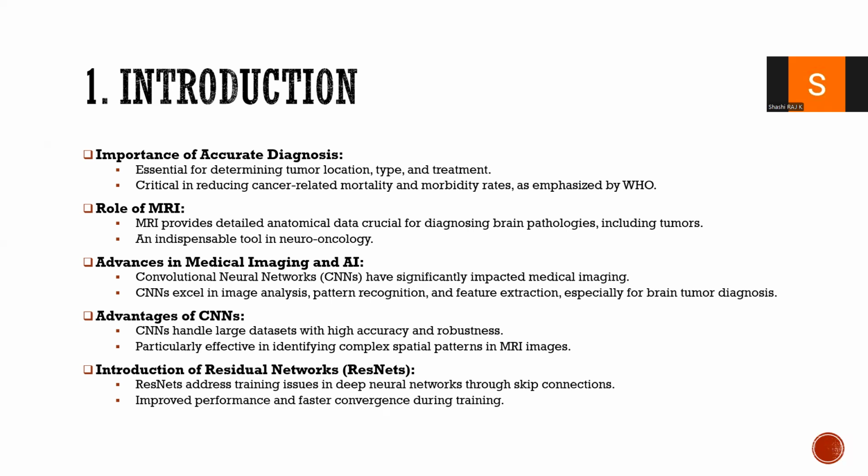Advances in medical imaging and AI. Convolutional neural networks have significantly impacted medical imaging. CNNs excel in image analysis, pattern recognition, and feature extraction, especially for brain tumor diagnosis. Advantages of convolutional neural networks are that they handle large data sets with high accuracy and robustness, and are particularly effective in identifying complex spatial patterns in MRI images.